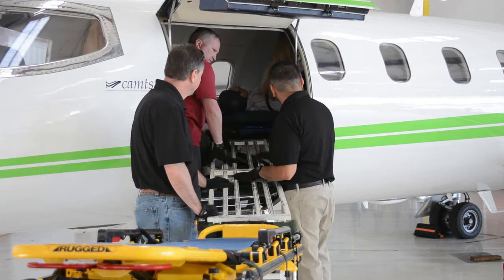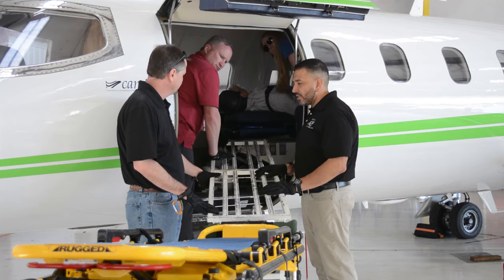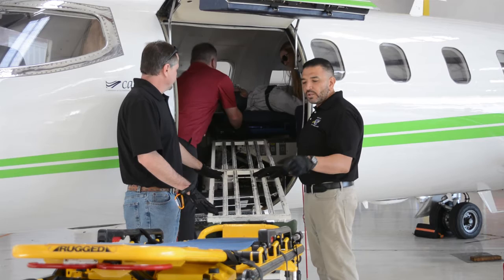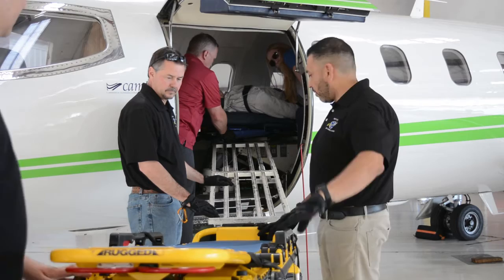Okay, so we're ready. We've dropped everything. We're locked into place. We've communicated with the EMS about where we need them, and we're ready to offload the patient. So one of the most important things is having somebody stabilize our gurney over here at the head, because the gurney is going to slide back. So at least one person to actually hold the gurney so it doesn't slide as we get the patient loaded onto the gurney.